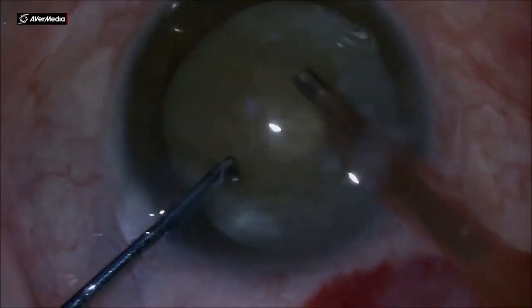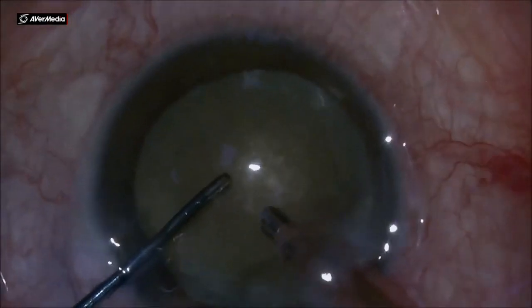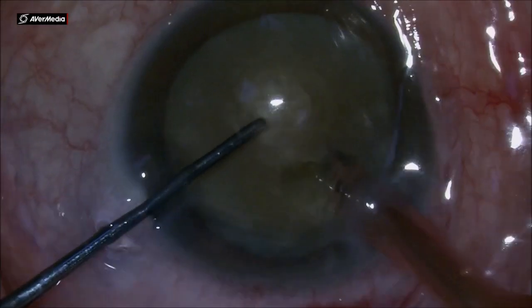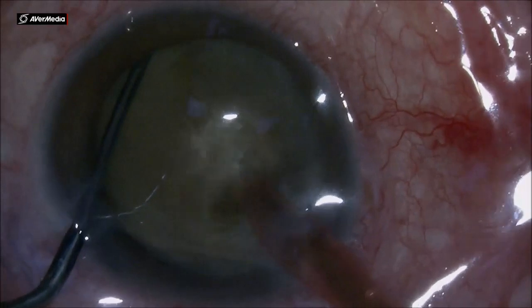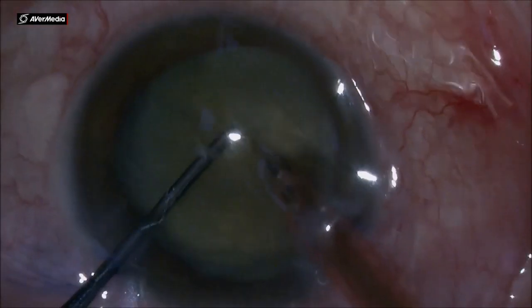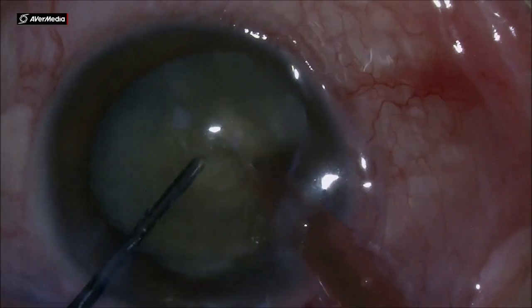On the first push of the foot pedal switch, I engage the anterior capsule, but I release it and everything is back to normal. Making a small trench to embed the phacoemulsification needle inside the middle of the nucleus and attempting a crack.